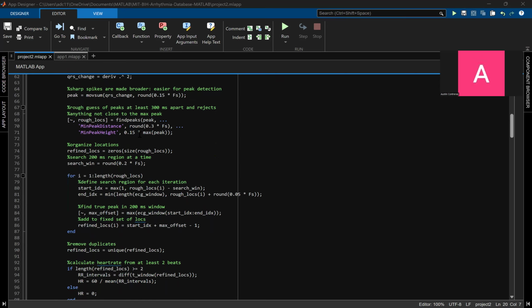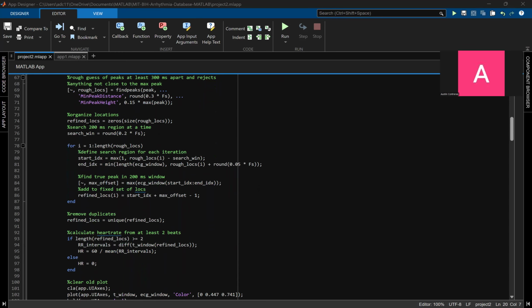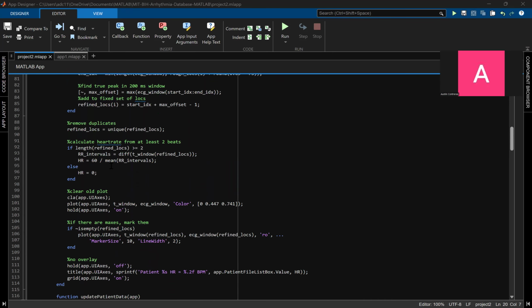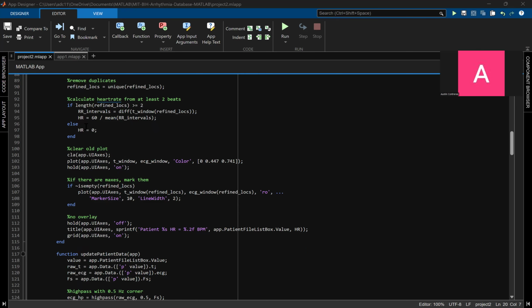Using findpeaks to save locations, organize locations, and then searching windows, and making sure there are no duplicates, which gives the refined locations. And then going through the rough guesses, you index from the beginning of the window to the end of the window using the 200 millisecond region, and then you save that to the refined locations, and then use that to calculate the intervals using the R peaks or the QRS peaks.